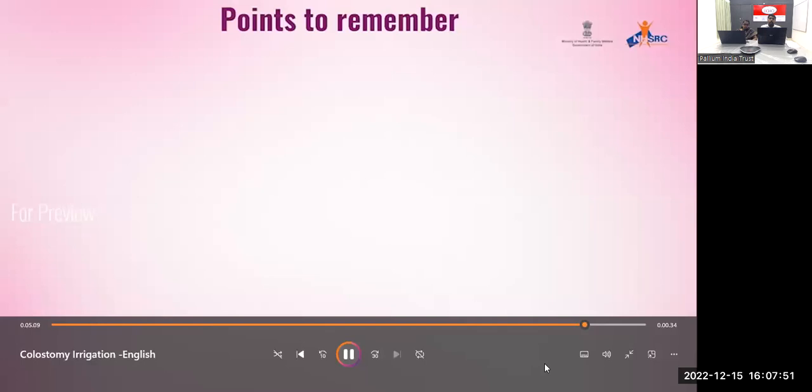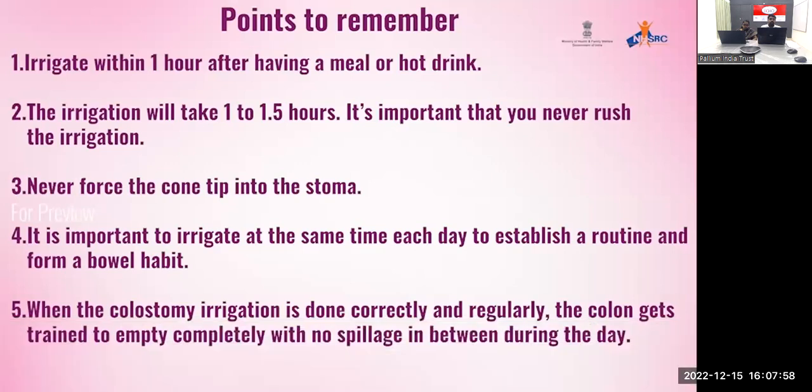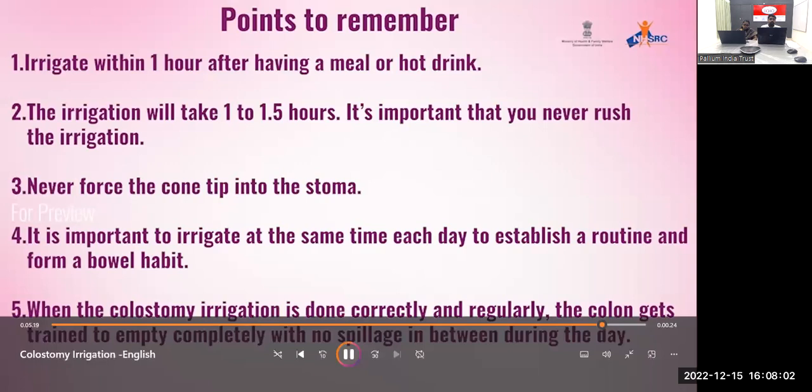Points to remember. Irrigate within 1 hour after having a meal or hot drink. The irrigation will take 1 to 1.5 hours. It is important that you never rush the irrigation.